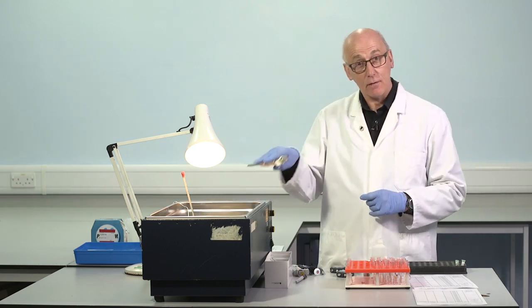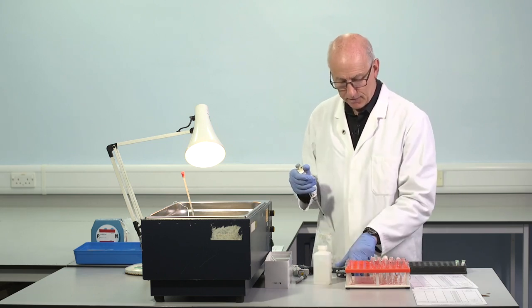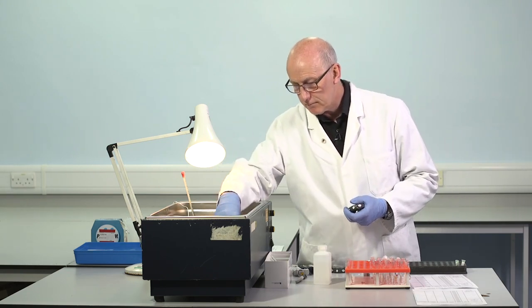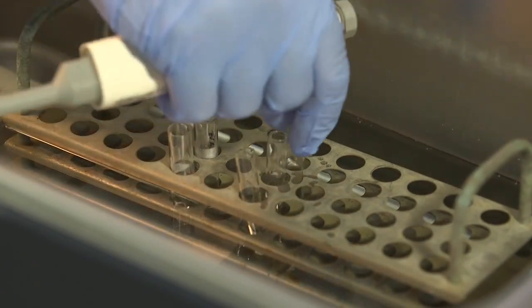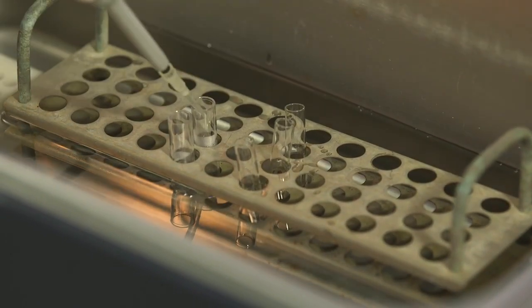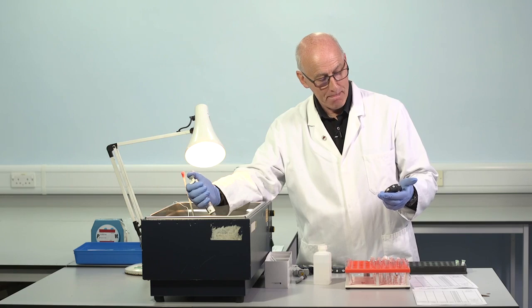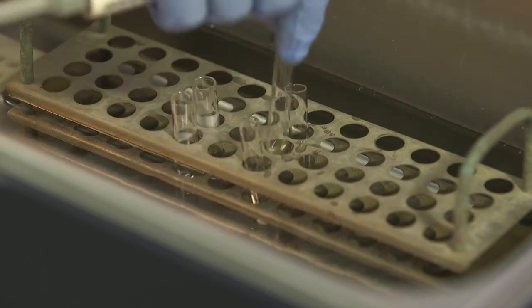APTT reagent, warmed to 37. To the first tube, start the watch. 3-minute activation for this particular APTT reagent. Second tube, 15 seconds and mix.